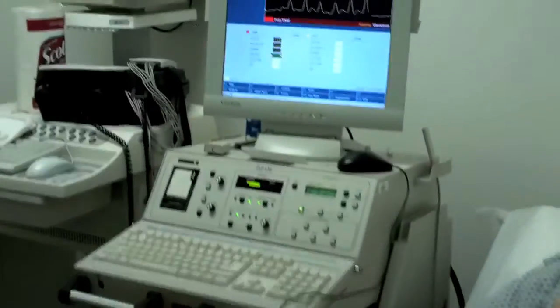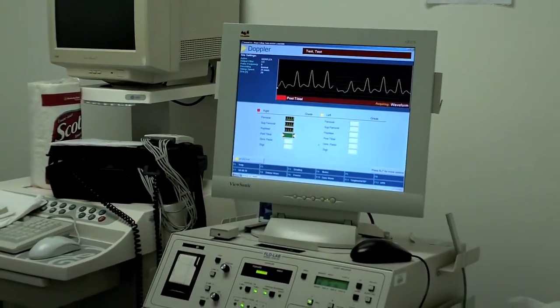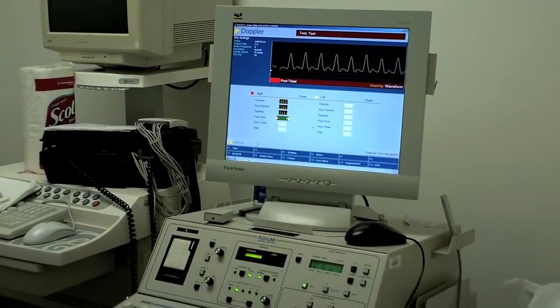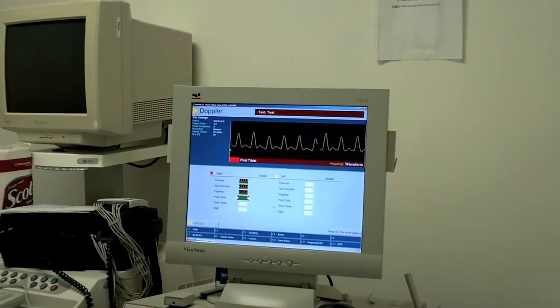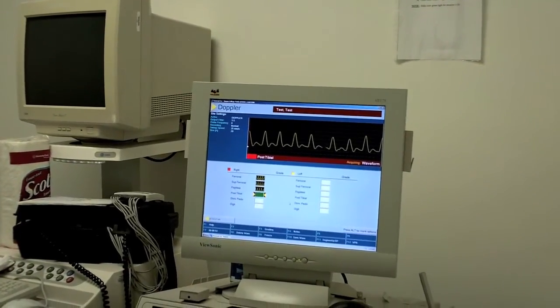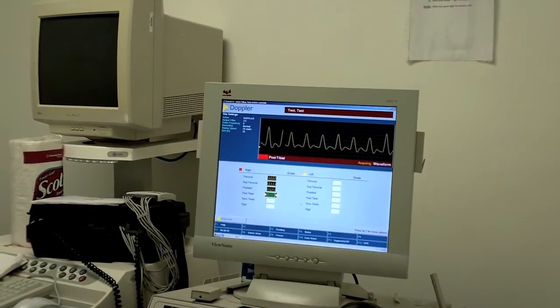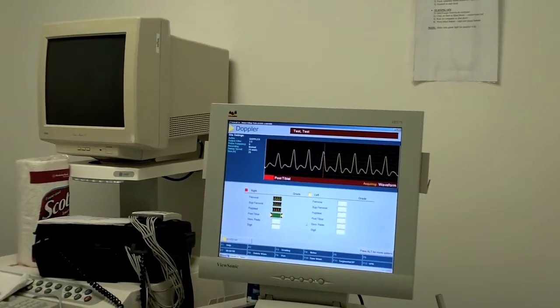There, I can hear it. Then I'm going to look at the screen and see what it looks like. And you can see as I move side to side that it gets louder and then softer. I want it where it's loudest, and it sounds, again, that triphasic signal. And then I'm going to freeze and save it.